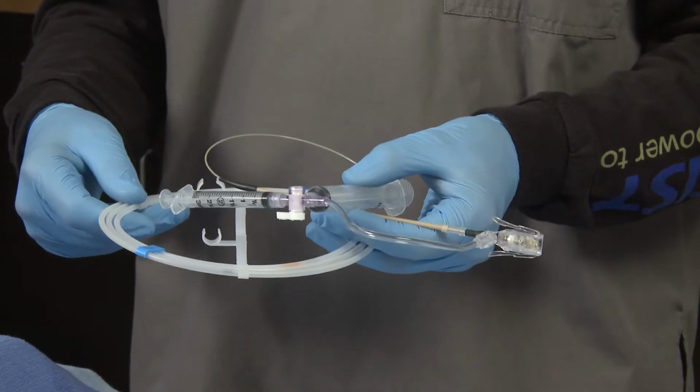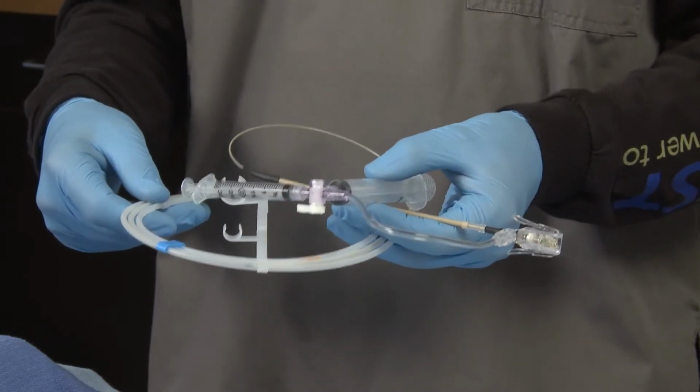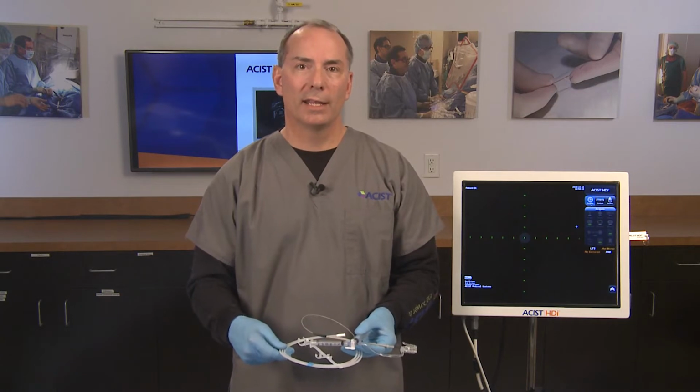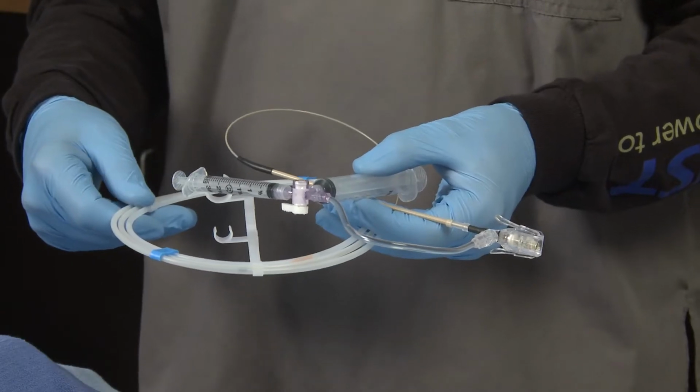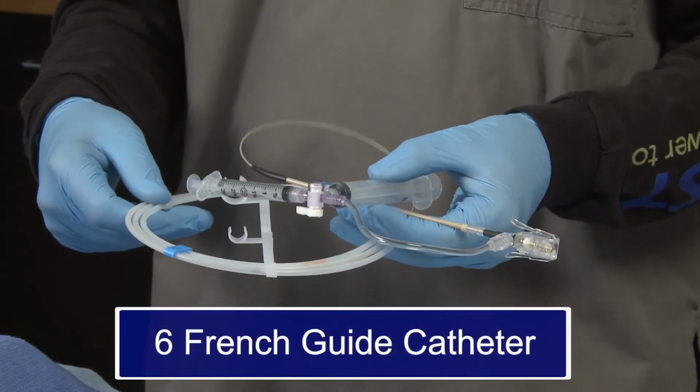The Kodama catheter is a minimally invasive intravascular ultrasound imaging catheter for the examination of human coronary and peripheral pathology. The sheath assembly has a hydrophilic coating that enhances catheter lubricity when introduced into the guiding catheter and coronary anatomy. The Kodama catheter is compatible with 6 French and larger guide catheters.